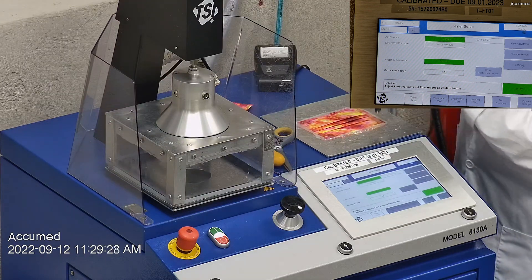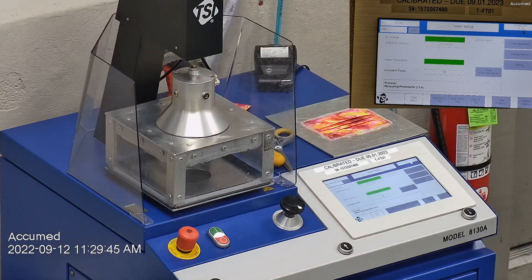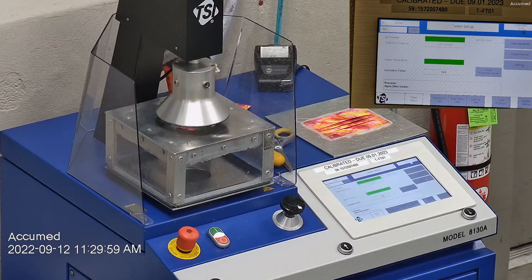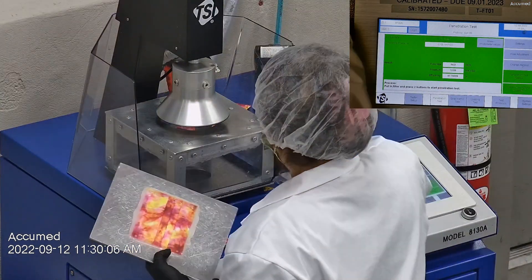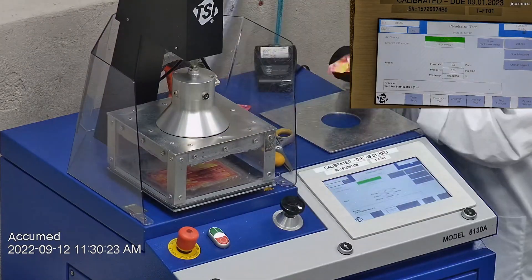F stands for airflow rate, which we test at 85 liters per minute. R is for resistance, also referred to as pressure drop — this correlates with breathability, so the lower the number, the more comfortable and breathable the mask is. E stands for filtration efficiency percentage.